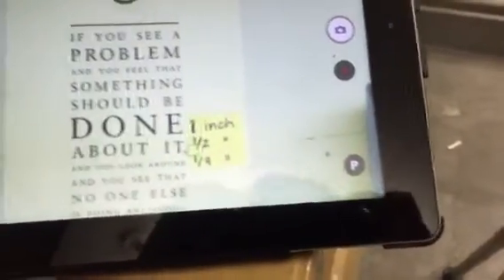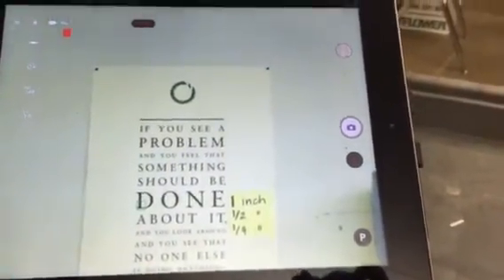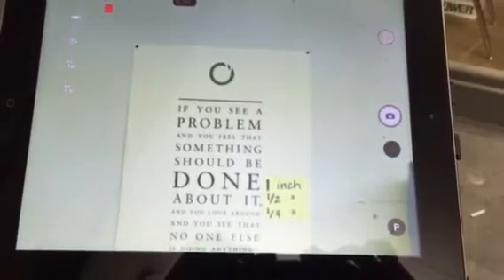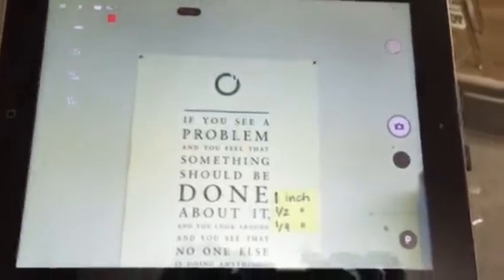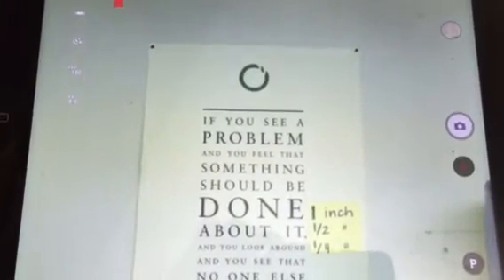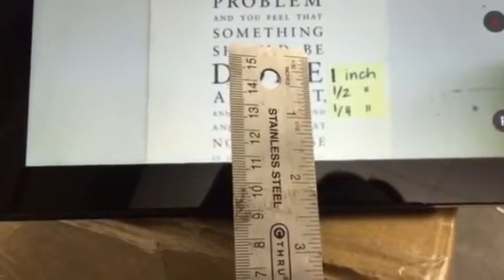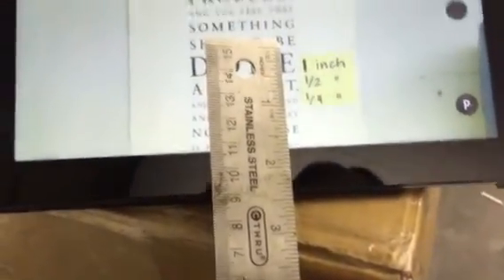I can tap the screen to focus that in. The conditions here right now under fluorescent lights and dark windows is not ideal. But I am probably about 15 feet away and I'm on the screen of the iPad looking at the print on the poster across the room. The one-inch letters on the poster at about 15 feet are now about three-eighths of an inch on the iPad.